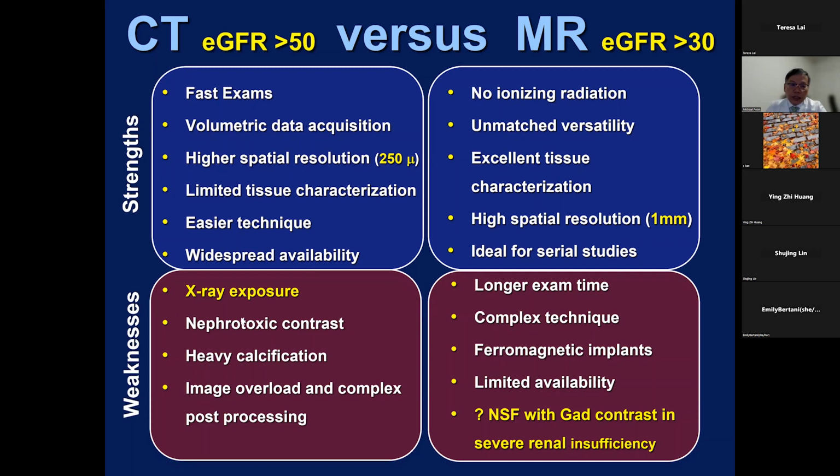The concern with CT is X-ray radiation, of course, and nephrotoxicity. We talk about what we need from the blood test in order to have the patient go for the CTA. MR, same thing, is a complex technique. You need an expert to do this, it's not easy. We are one of the few centers in the entire New York area offering this high level of cardiac imaging. In fact, we get referrals from hospitals because they don't have that kind of expertise.